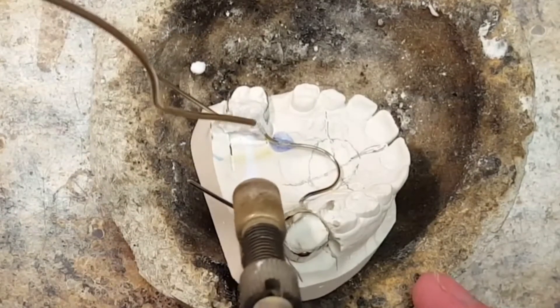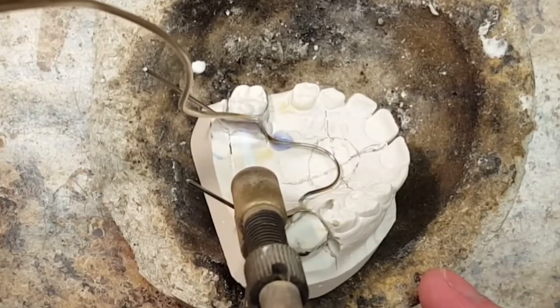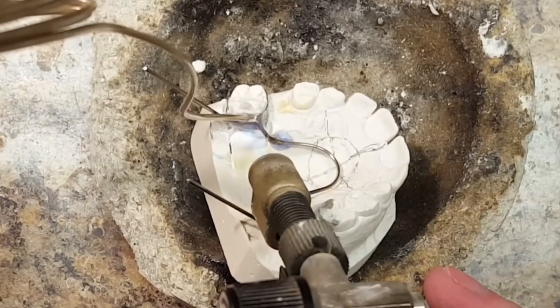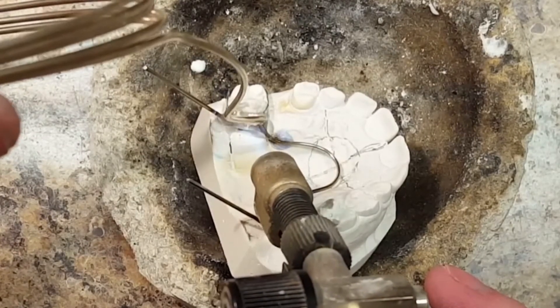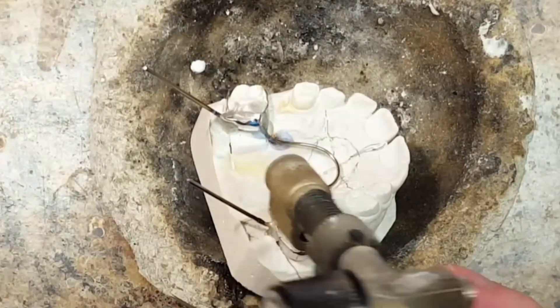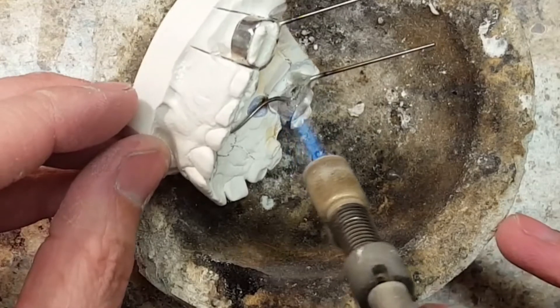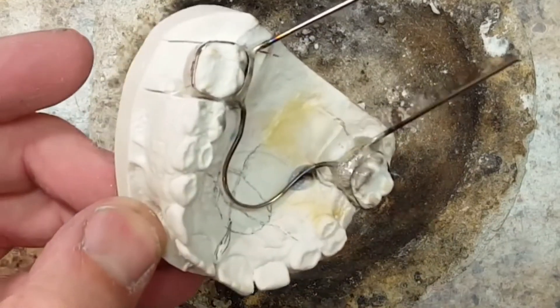It doesn't take much to solder this appliance, but you do have to be pretty accurate. You don't want any porosity or bubbles from overheating the wire. If you do this fast and productive, you don't really need to use heat shield. Sometimes I do use heat shield to protect the wire, but I'm pretty fast at soldering. If you solder too long and overheat the wire, you'll anneal it and that'll cause breakage.